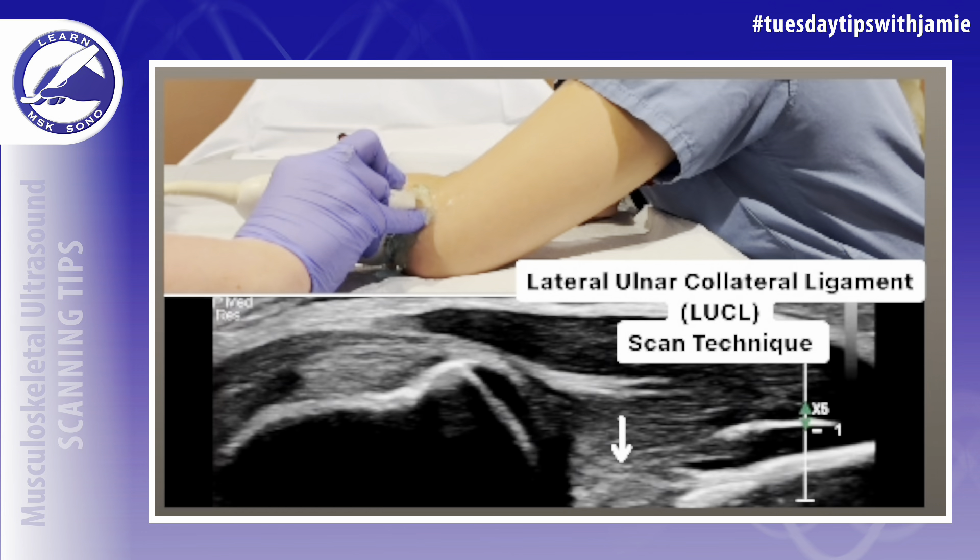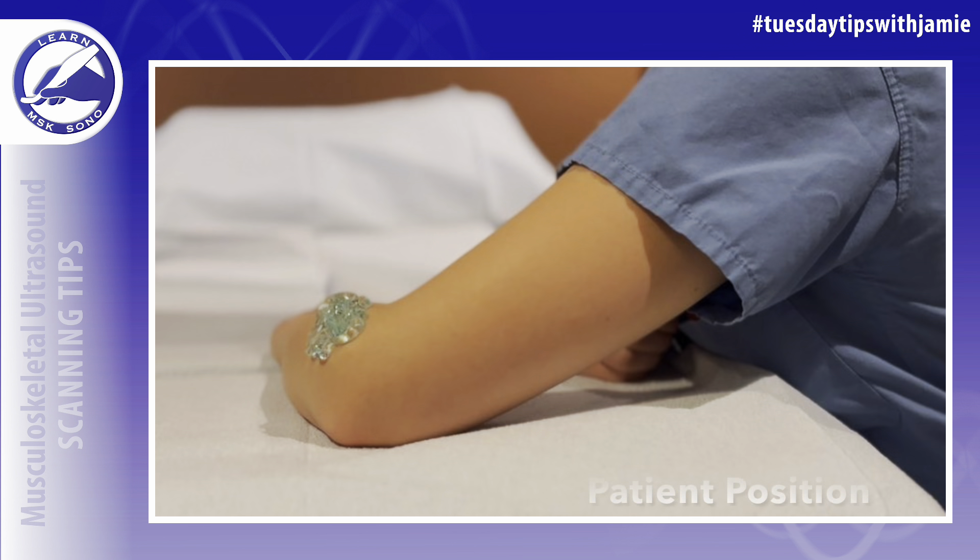Do you know how to locate the lateral ulnar collateral ligament of the elbow with ultrasound? The patient should sit in a chair adjacent to the exam table with their elbow pronated and internally rotated, exposing the lateral aspect of the elbow to the examiner.